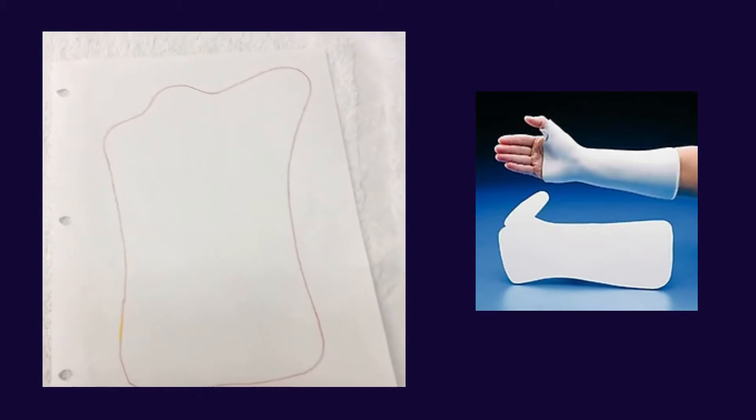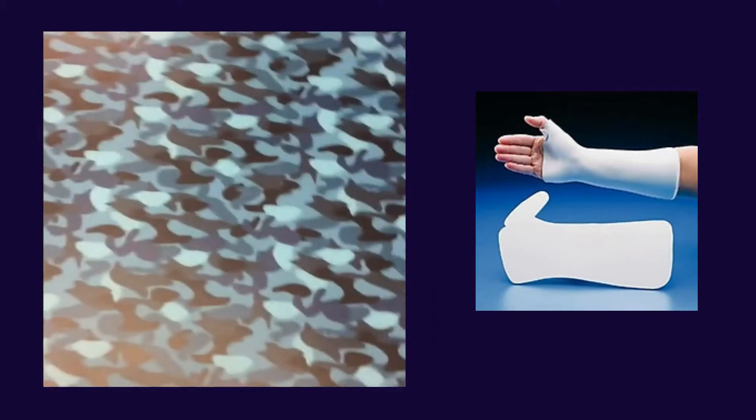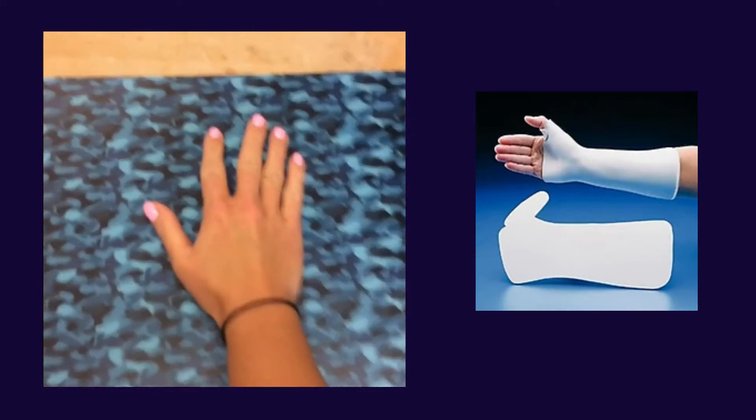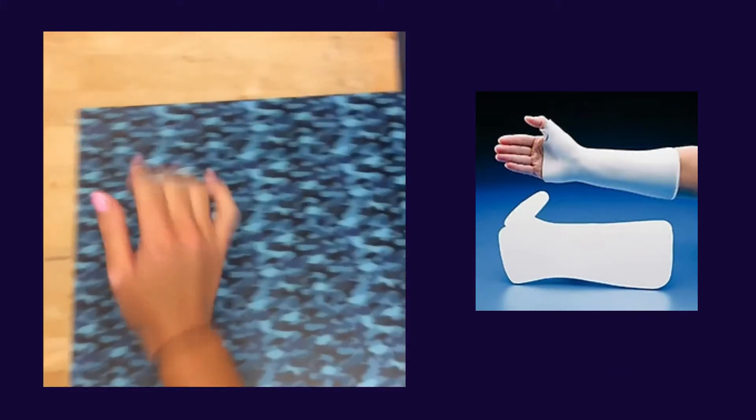Next, if you have a pattern, you can cut it out and trace it onto the thermoplastic, or you can trace the patient's hand and forearm without using a pattern. Heat the material up in the splint pan while ensuring your patient is in the proper position before beginning to fabricate.